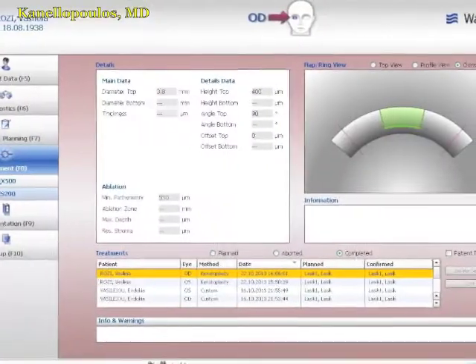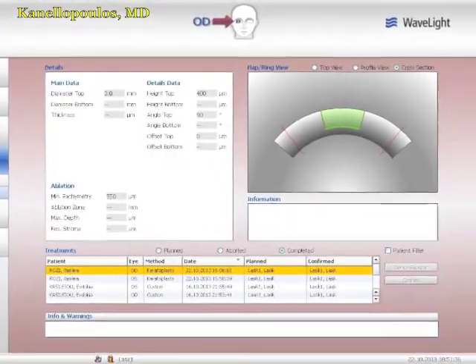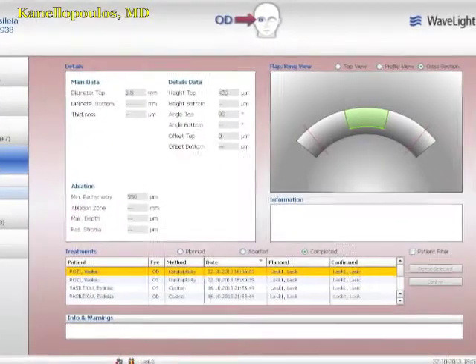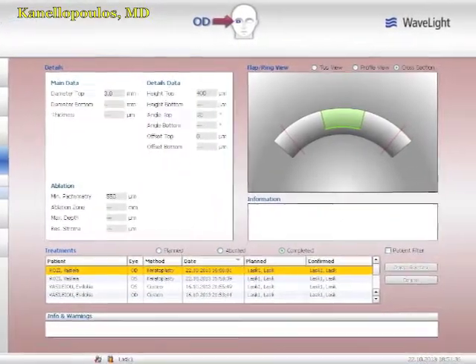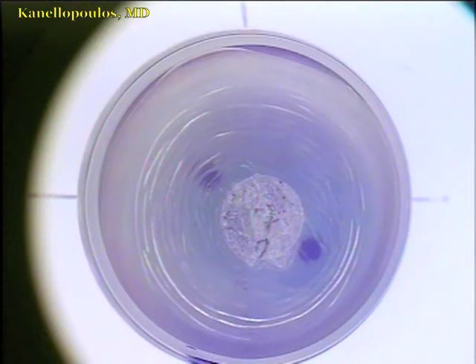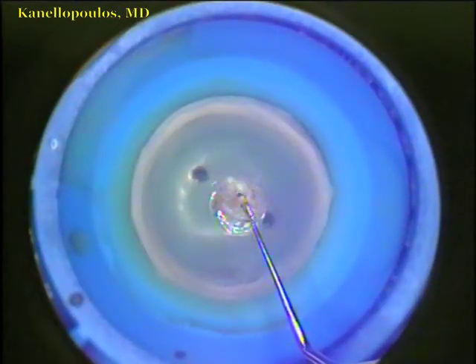Now, again applanating this cornea and taking out a 3.8-millimeter lenticule at 400 microns depth, again with the FS200 Wavelight femtosecond laser. We saw the applanation before, and now we'll see the trephination of this 3.8-millimeter lenticule. Remember, the prosthesis is 4 millimeters in diameter, but we want the optical head of the prosthesis to fit snug within this trephination.